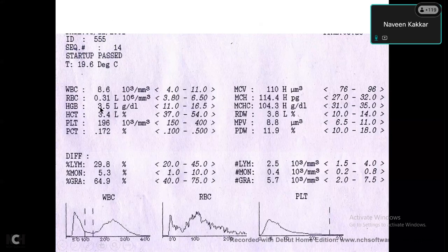Your hemoglobin is 3.5, and we expect the hematocrit to be 3 times that, roughly, which is 10 plus. That's similar, 3.4. RBC count multiplied by 3 should be hemoglobin, even that's not right. So the rule of 3 in hematology has been violated here. How are our indices calculated from these 3 parameters?